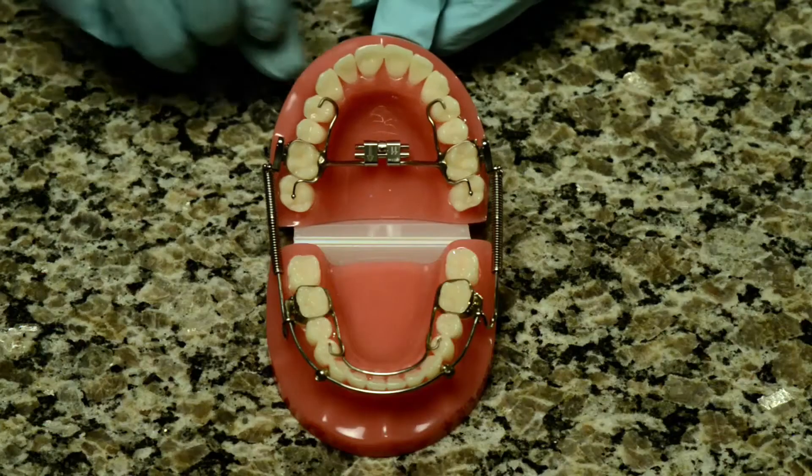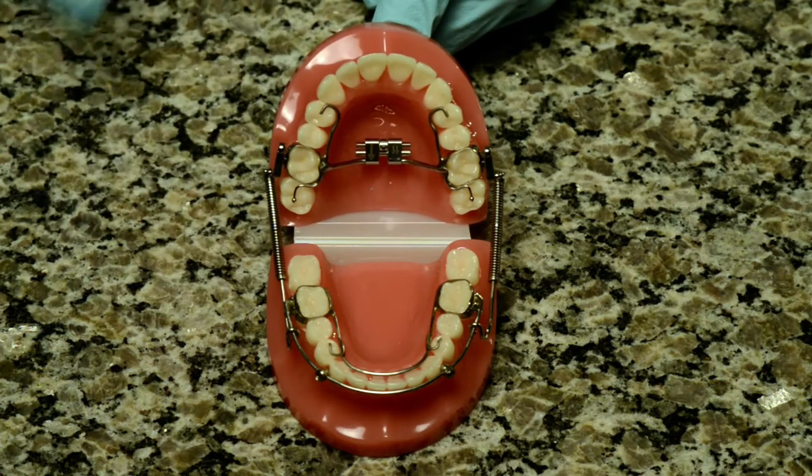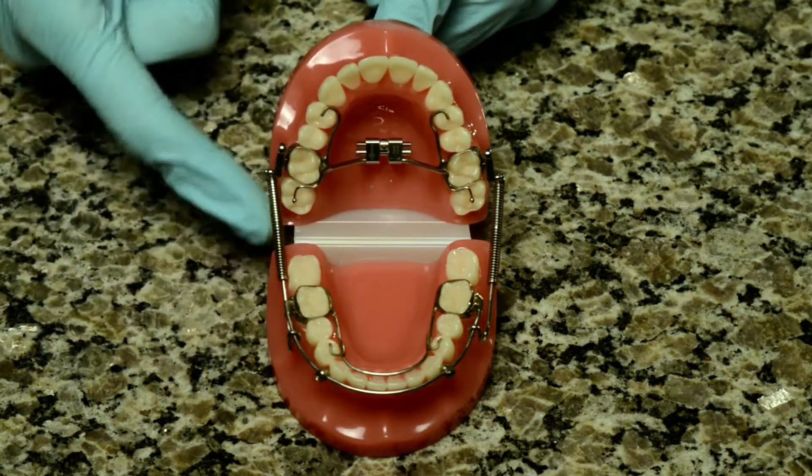The Crossbow Appliance is used to correct overbites. It consists of two portions, one for the upper jaw and one for the lower jaw. They are connected by spring attachments to the upper molar teeth and a push rod attachment to the lower wire. The appliance works by pushing the top teeth back and the bottom teeth forward.